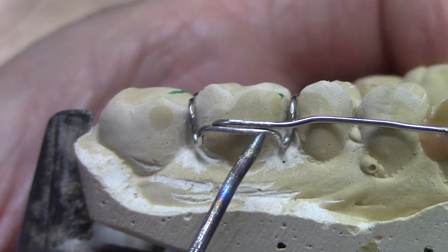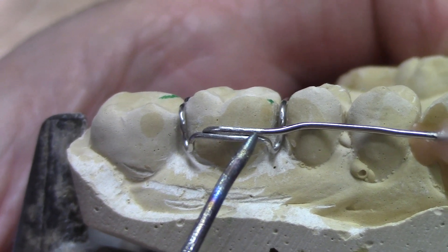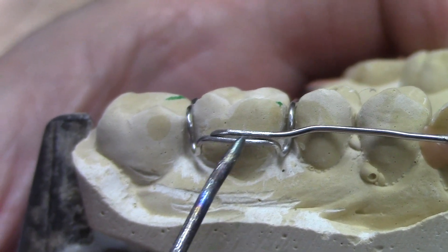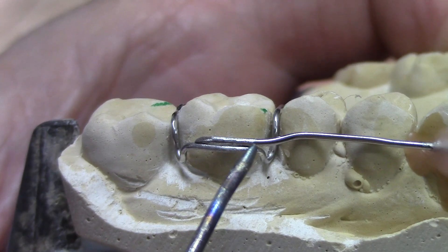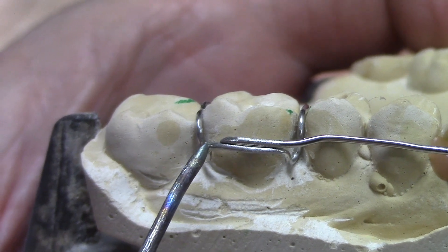I'm also going to use a nickel silver alloy solder. It is highly resistant to tarnish, and tarnish is what corrodes the surface of the solder — over time that causes it to get brittle and break down. So I'm going to use a solder that will keep that from happening.